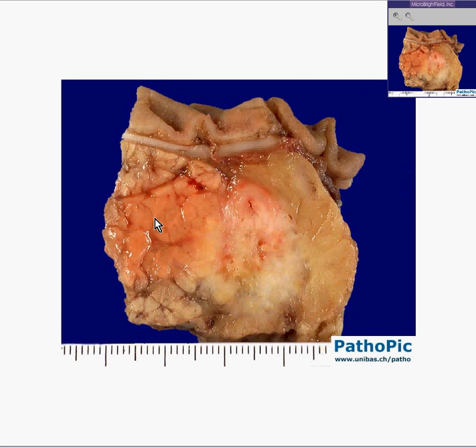In most exocrine organs — salivary gland, pancreas, lacrimal gland — you can see an overall general lobulation, which are these little lobules with a little bit of fibrous tissue between them. They still look like they're organized. You can see lobules here as well; they're just a little pinker or perhaps more hyperemic than usual.